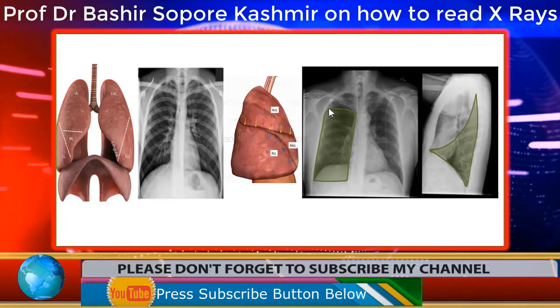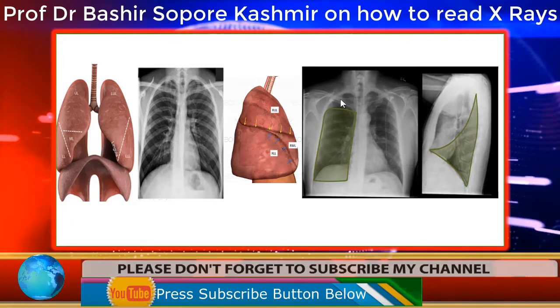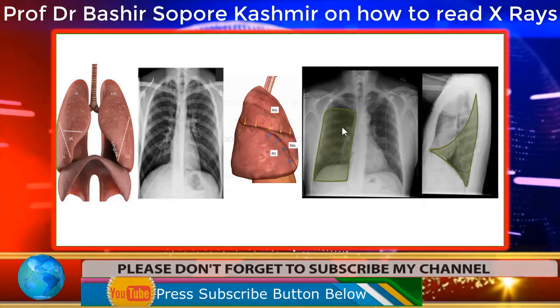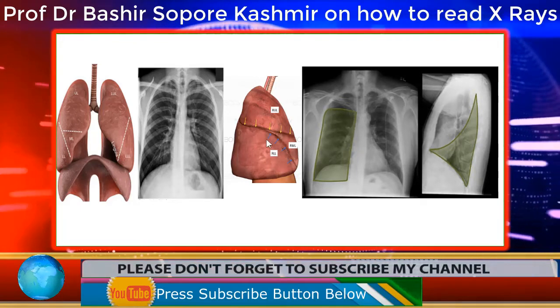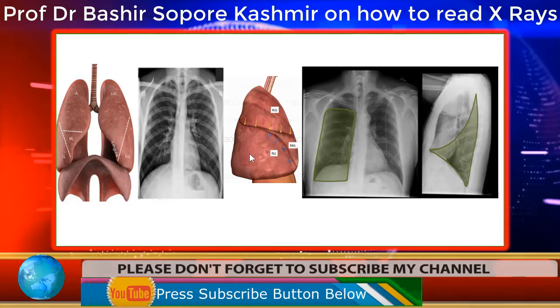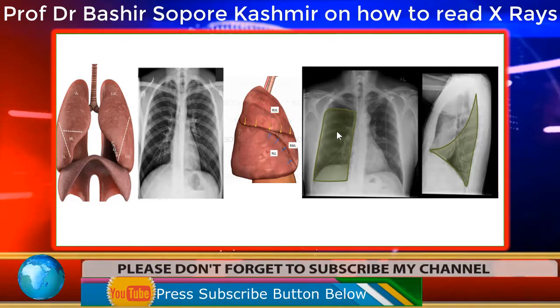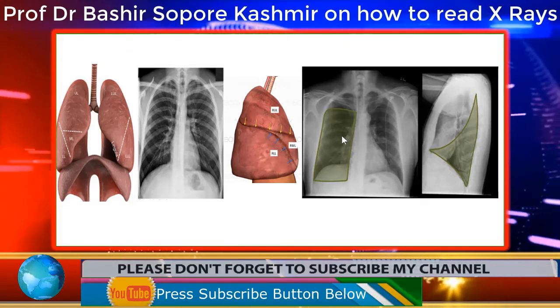Now, the upper area of the lungs is clear and it is dark due to the air. So the upper lobes are not involved. And from the horizontal fissure down is radio opaque. It doesn't mean that the middle lobe is involved here, because this is because of the superimposition. So if this whole area from here to here, the lower lobe, becomes radio opaque due to various pathologies, then this radio opacity will overlap this area. So this area will also appear white. So we can get the whole area from this line, the horizontal fissure, downwards, that might become radio opaque, right?